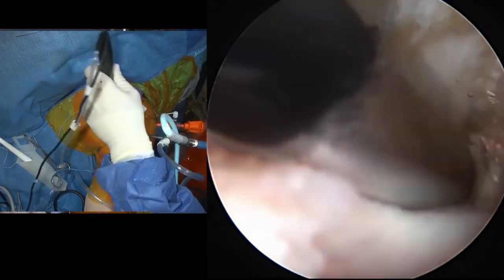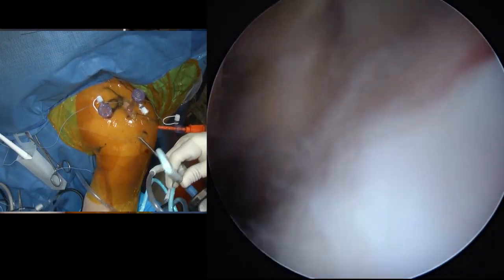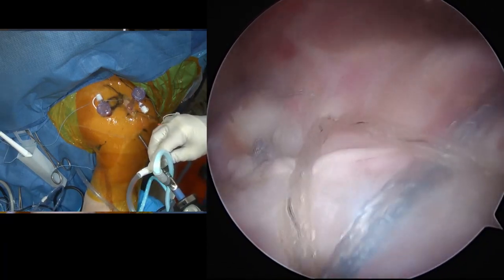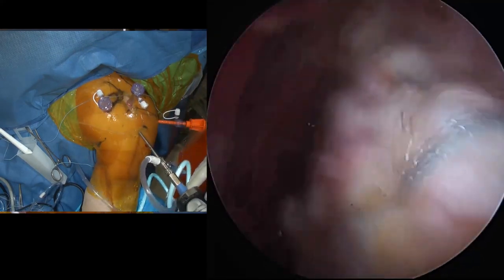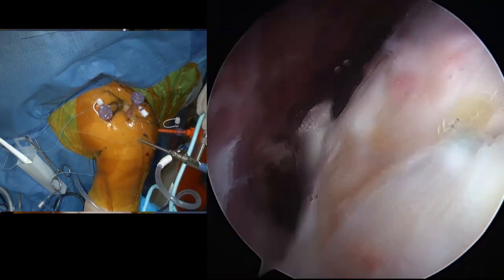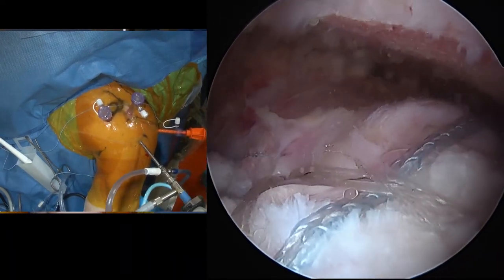So then we don't have to worry that that's trapped in the repair and that we might injure or rip out our repair. And again, we make sure we have enough pictures here for the patient. Acromioplasty there. And then the biceps tendon over here. And then back to the repair. Okay, so let's get our biceps done and we're all set.